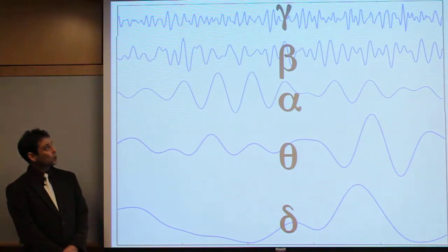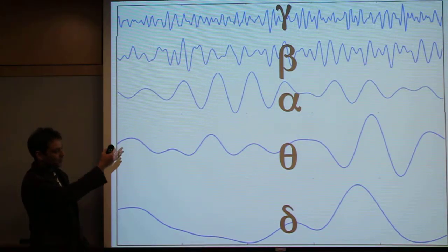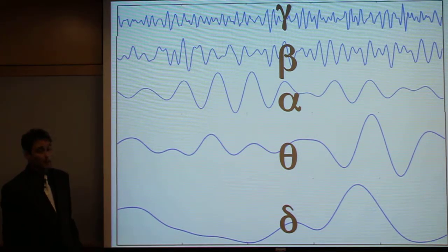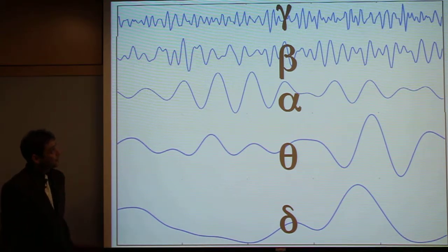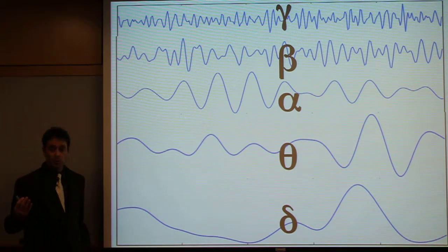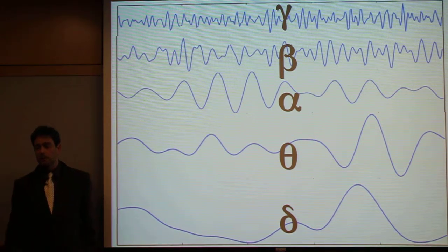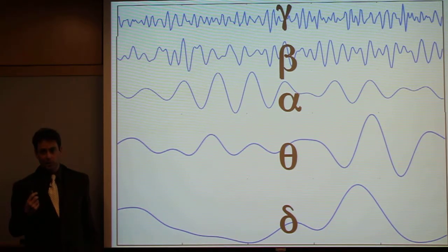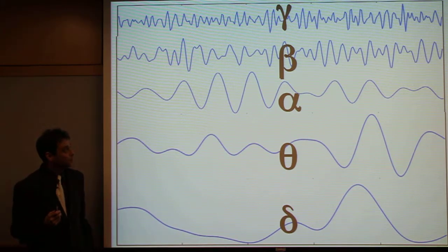I'm going to talk briefly about electroencephalography waveforms now. And this slide shows the waveforms separated from gamma, beta, alpha, theta, and delta. Gamma are the highest frequency waves, and they're from about 30 or 40 hertz all the way up to hundreds of hertz. Unfortunately, the skull filters out the gamma waves, and we frequently can't assess gamma from surface EEG.